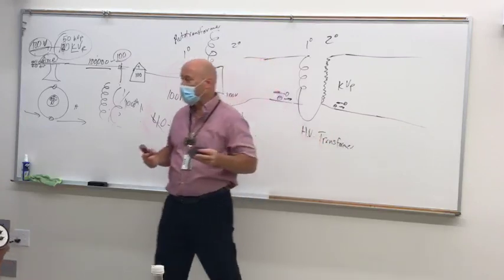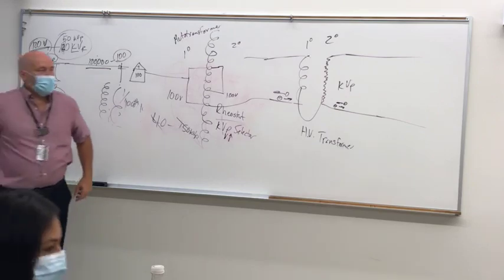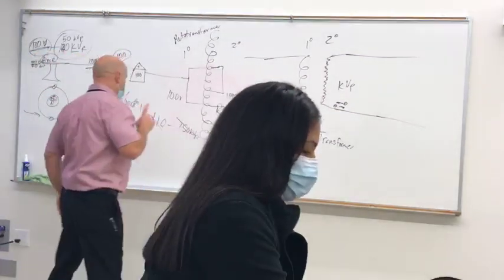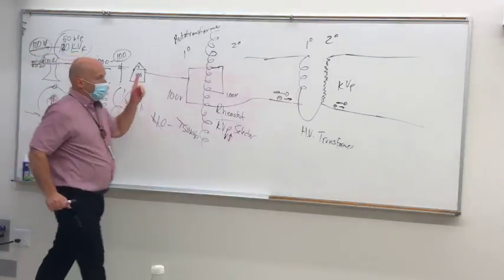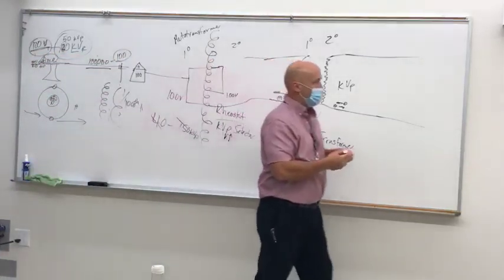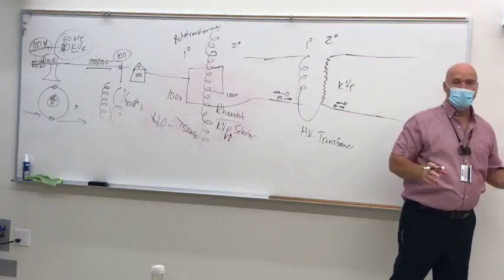You've got a couple of different wires inside of it, just like a light bulb. So we're going to take the electricity that we've transformed from low voltage to adjustable high voltage, and send it into the x-ray tube. In the x-ray tube, on one end, we've got this thing, kind of like a little cup, and it has two filaments in it. The purpose for the two filaments doesn't really matter at this point. We'll get into it.